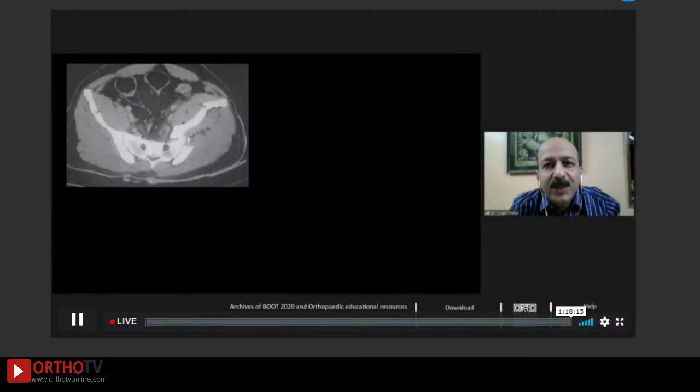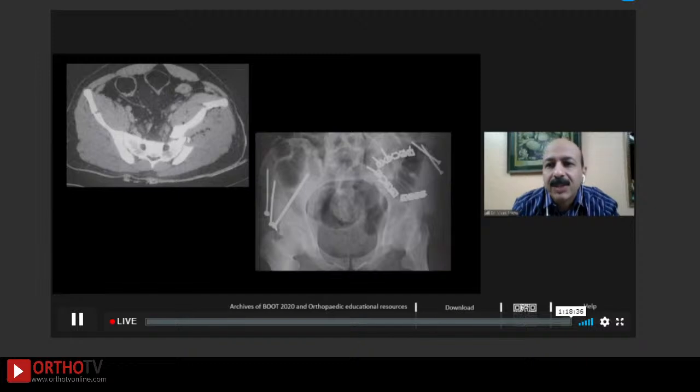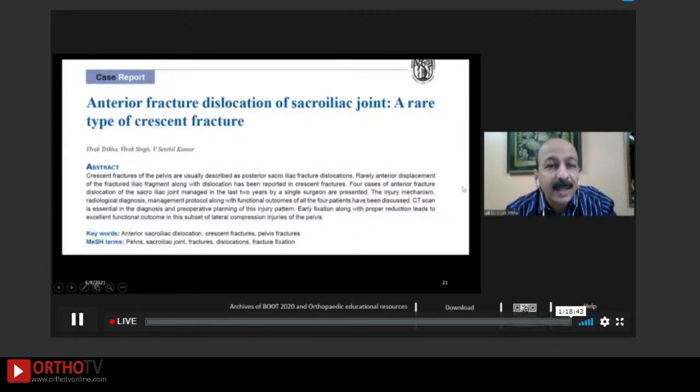And another case, which is again showing the same thing, ala lying, the ilium lying in front. This is a variant, I would say, of a crescent fracture, which is not going posteriorly. The vector component is going from posterior to anterior, and maybe the ilium is just going and cannot recoil back once the fracture has happened from the SI joint, crescent sort of a fracture. And exactly the same thing which we did for this part, and the crescent was fixed like this. We published this in one of our case series in the Indian Journal of Orthopaedics also.